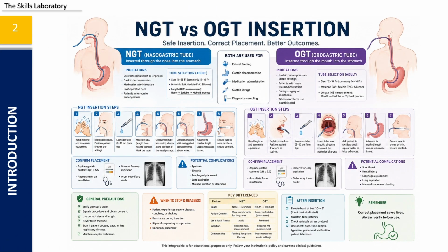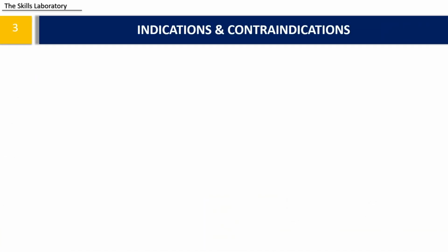Okay, so this is the overview of our discussion for today, your NGT and OGT insertion. This is a helpful infographic. This is actually an AI generated infographic, which is very helpful for guidance. Okay, so let's proceed. What are the indications and contraindications for your NGT and OGT insertion?